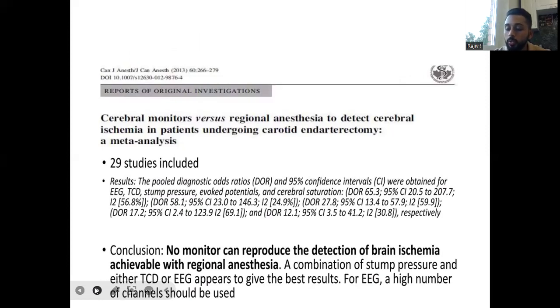But one more thing that we do nowadays is we do a transcranial cerebral oximeter. So we put two patches over here, and with the dural venous sinuses, it constantly shows during the surgery what is the oxygen perfusion rate. Just like we have SpO2, it shows the transcranial oxygen perfusion ratio. And also after the clamping, it should not go more than 20% down.